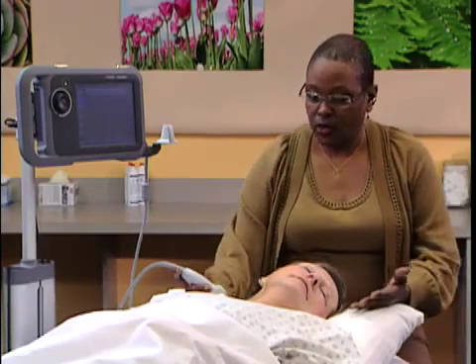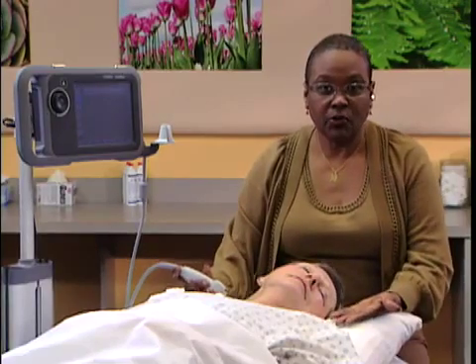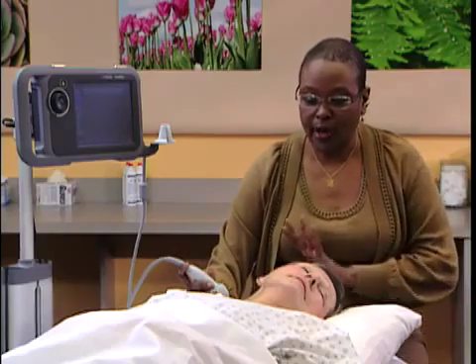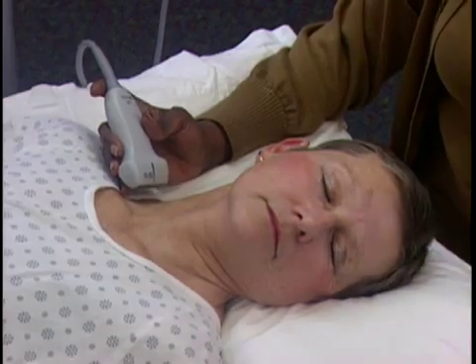When you're scanning from the patient's head, you want to position the height of the table so that it's comfortable and you're not holding your arms up in an uncomfortable manner. You want to have the patient lie with their head turned away from you — whichever side you're scanning, have the patient turn their head away.